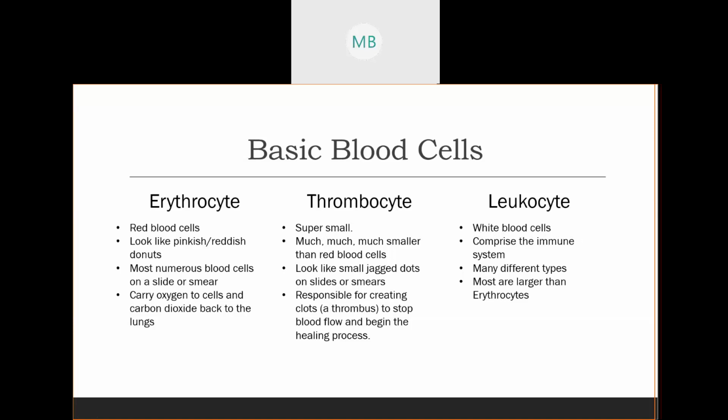Once again, we'll hit that more later on in this video and talk about it way more in depth in lecture. But most of these leukocytes are larger than your red blood cells. So most leukocytes are going to be bigger than your erythrocytes.